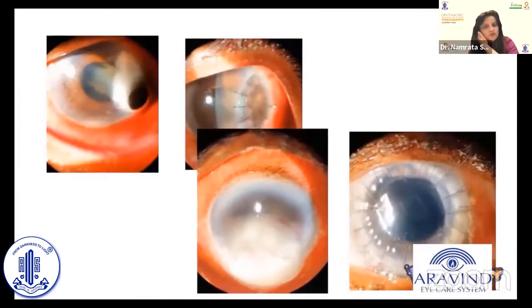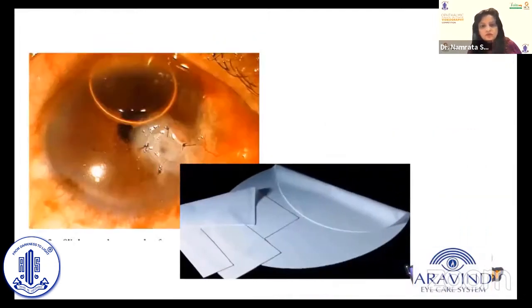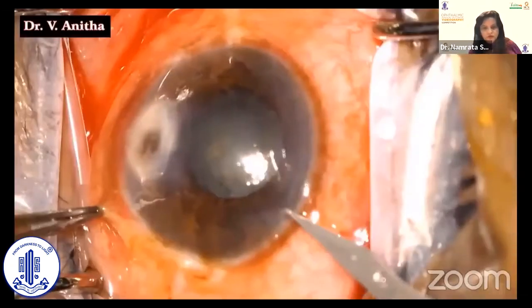We have used Tenon's patch and Gore-Tex for a 50-year-old female patient who presented to us with a peripheral perforated corneal ulcer of size 5 by 5.5 mm.